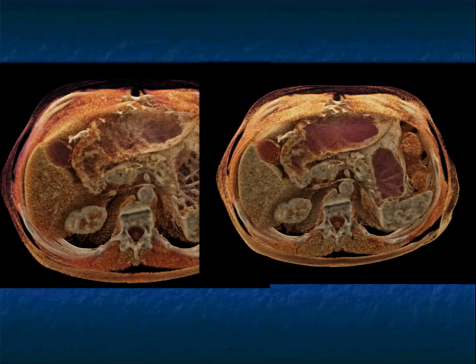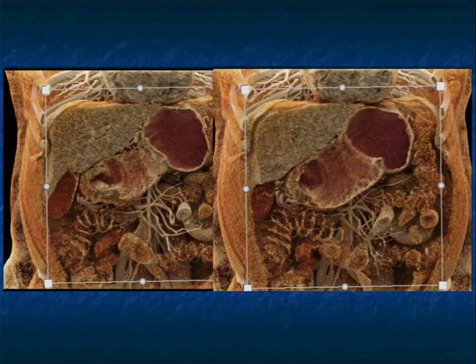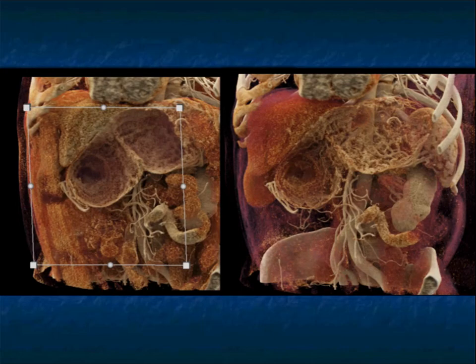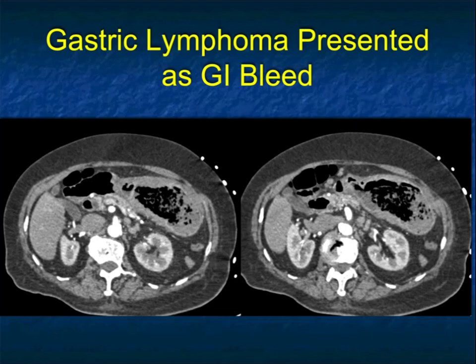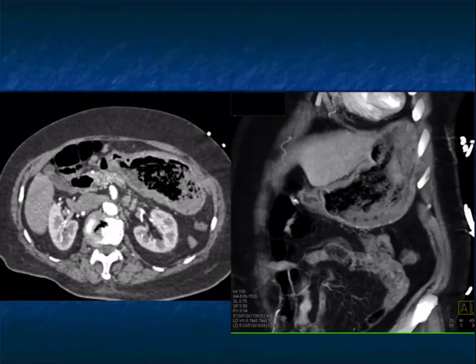A great example showing why adenocarcinoma and lymphoma can look very similar. In this case you would know it's a neoplasm, but only with endoscopy could you make the right diagnosis. Cinematic rendering nicely shows the infiltration and tissue mapping — you can see the differential between mucosa and submucosa showing tumor extent. Another patient presenting with GI bleeding had a definite infiltrating tumor in the stomach with some nodes in the perigastric region. Again, I probably would have favored adenocarcinoma, which I did — and this ended up being lymphoma.